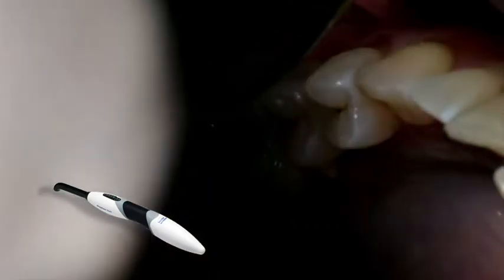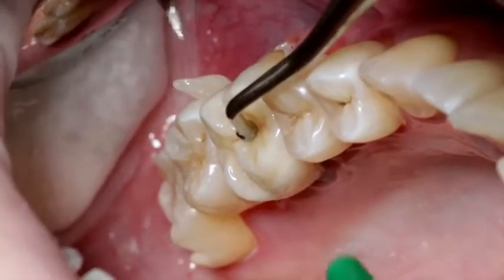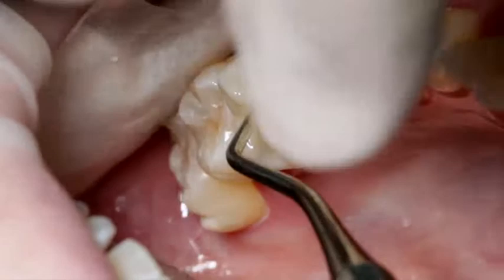Please note that the distance between the light probe and the restoration must not exceed 10 mm. You can now easily remove the gel-like excess using an implant scaler or dental floss for the proximal areas.